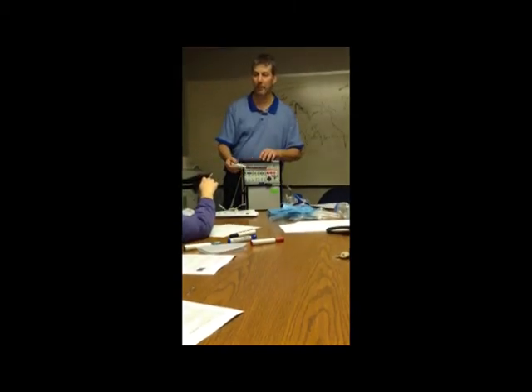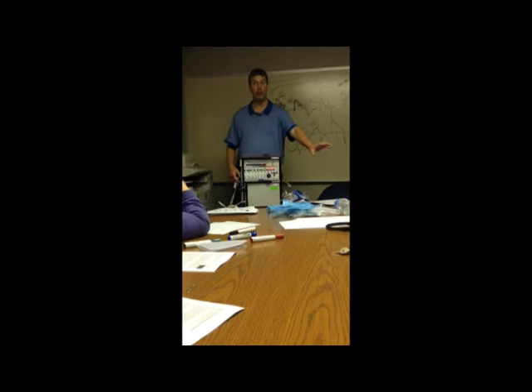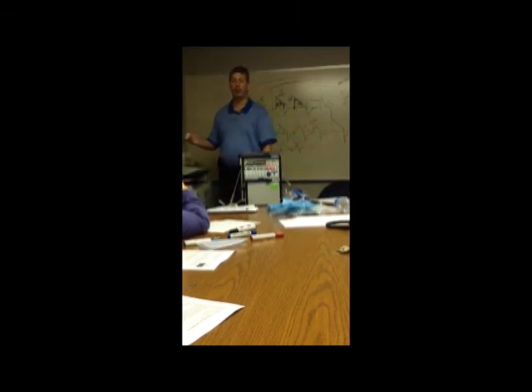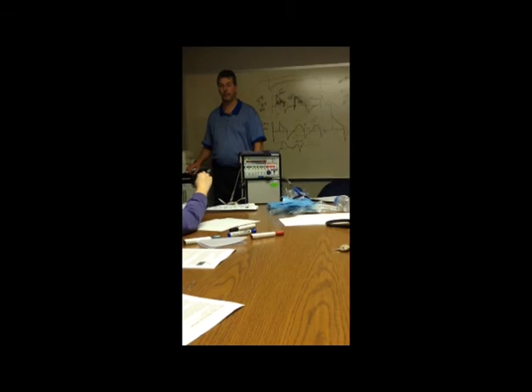So the PIP is the total pressure. It's the inspiratory pressure plus the PEEP. If it were 36, would that be considered about as high as you would want to go? That would be as high as I would go. Okay. And if you drop the inspiratory pressure to get that 700 down, if she looked okay with the lower volume, I wouldn't necessarily go up on her rate to compensate, because she always has the ability to breathe over the set rate. So she may be breathing 10 on 10, and I drop her volume, and she breathes a little over on her own.